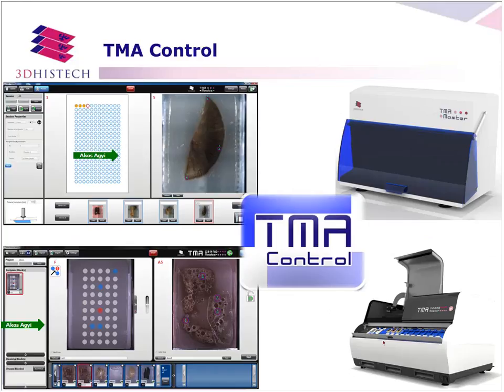As you can see on these screenshots, there are some differences on the graphical user interface between the two modes. This is because the two machines, the two hardwares are different in size and in operation. But as you probably already noticed, there are some common components too in this software.